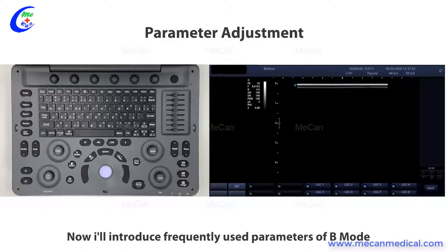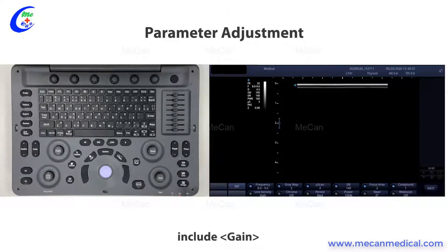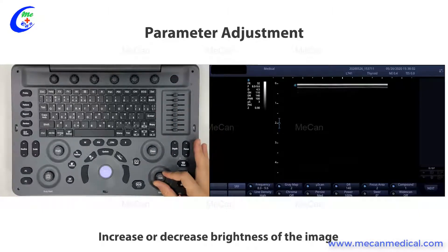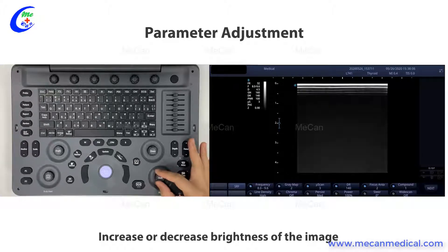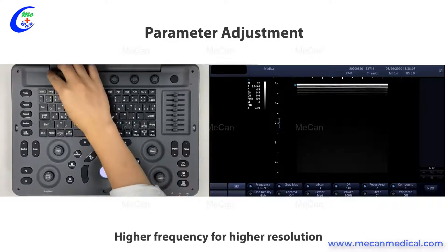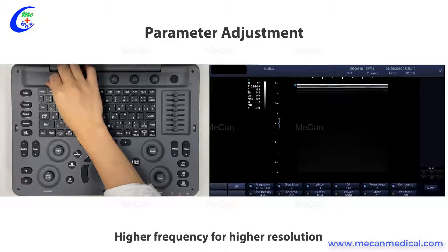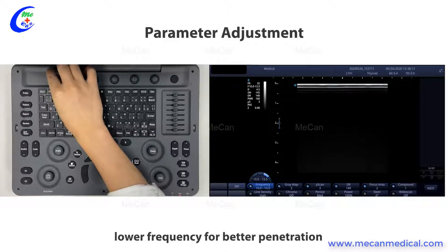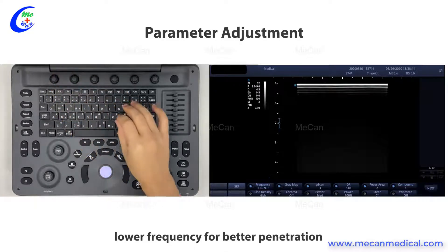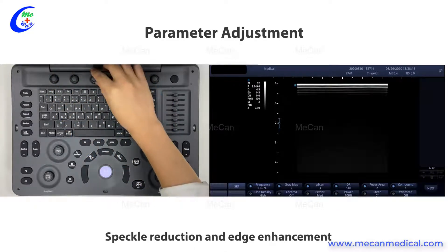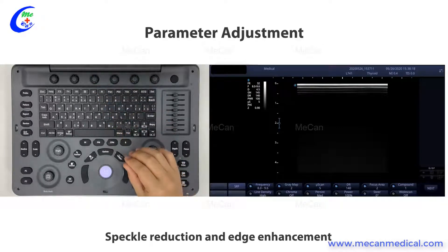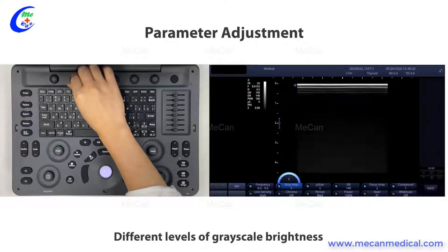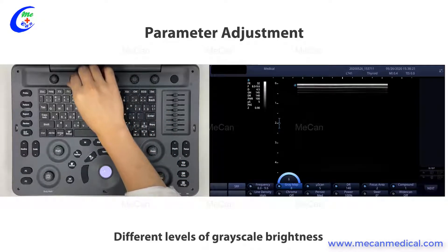I will introduce frequently used parameters of B-mode. Gain: increases or decreases the brightness of the image. Frequency: higher frequency for higher resolution, lower frequency for better penetration. μScan: speckle reduction and edge enhancement. Gray map: different levels of grayscale brightness.